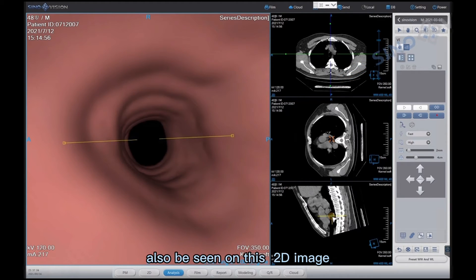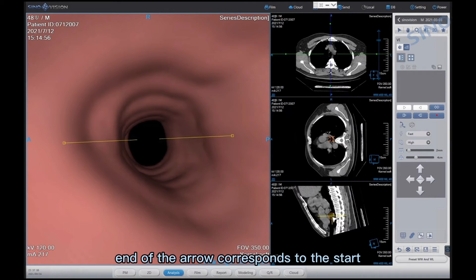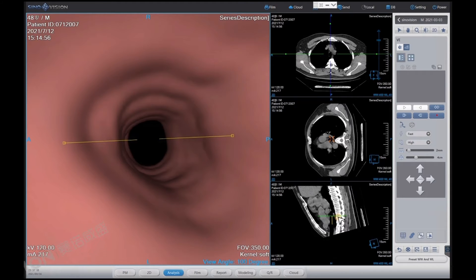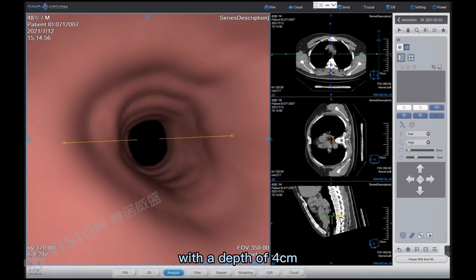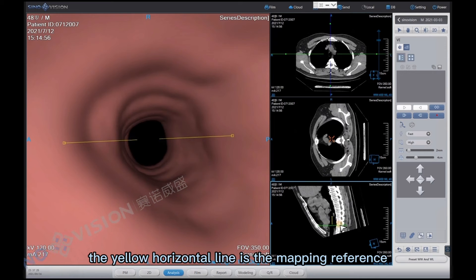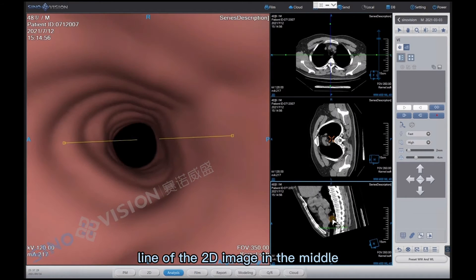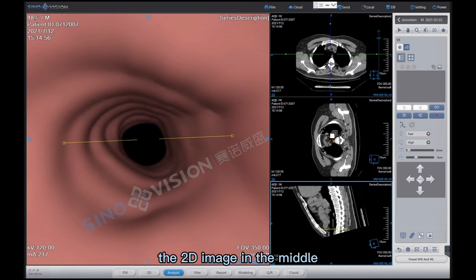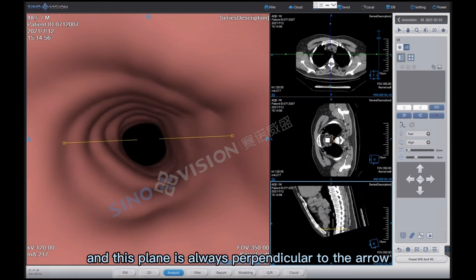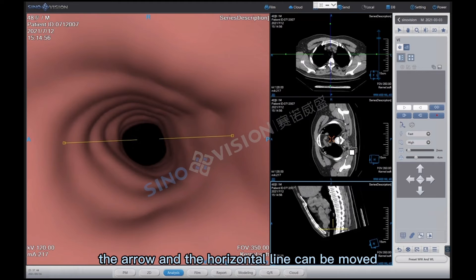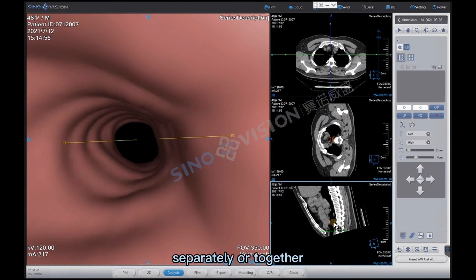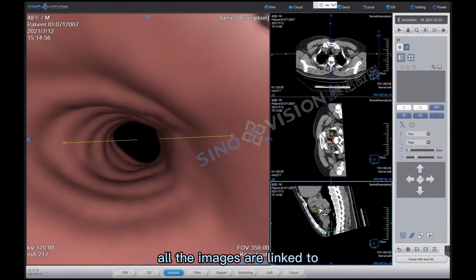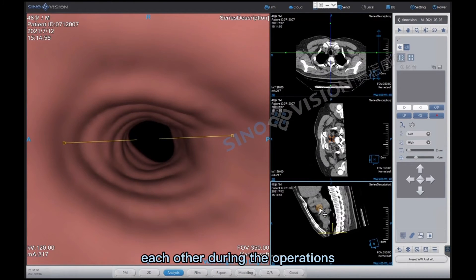And the start end of the arrow corresponds to the start viewpoint position on the VE image. And the arrow end corresponds to the position that can be seen with a depth of 4 centimeters. The yellow horizontal line is the mapping reference line of the 2D image in the middle. Moving the yellow horizontal line will change the 2D image in the middle, and this plane is always perpendicular to the arrow. The arrow and horizontal line can be moved separately or together. All the images are linked to each other during the operations.